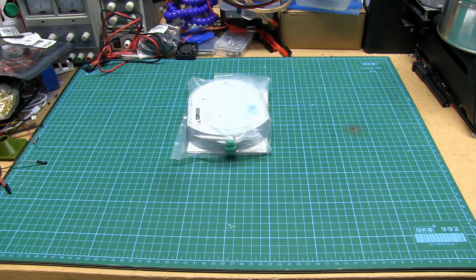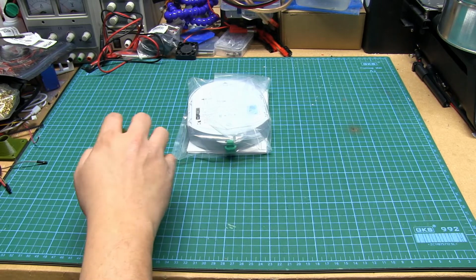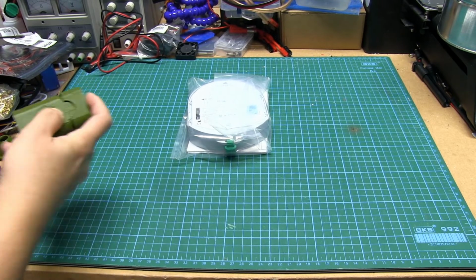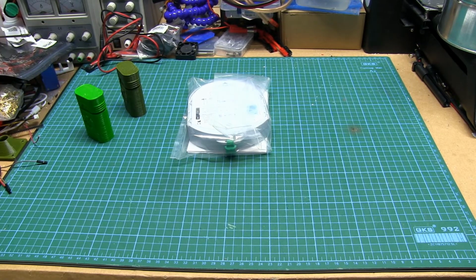Based on other videos, I suspect this is going to contain some CR123 cells. These are lithium primary cells that do not look like this. These are 18650s. These are also 18650s. Those are also 18650s. What the hell?